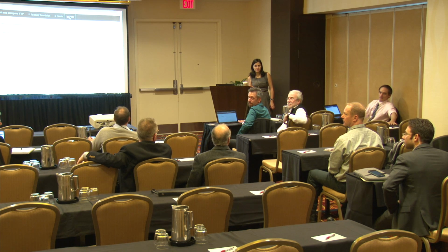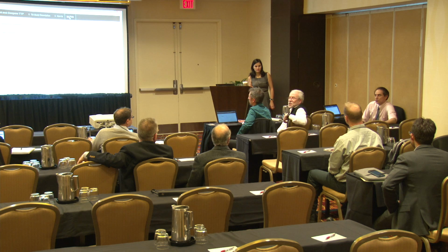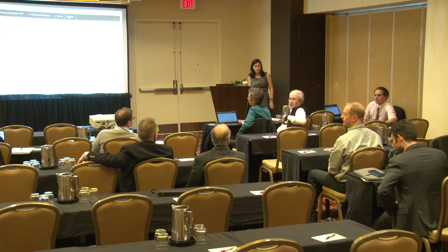I mean, 10 days is 240 hours, that's what is reported. Right. The machine reads out days, hours, maybe minutes. No, it only turns the UV lights on once every hour. Otherwise, they wouldn't grow. So then it's days and hours. Right. And we convert that to hours. That's what our database is.